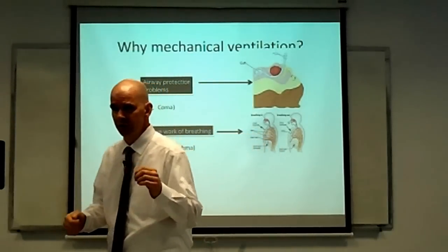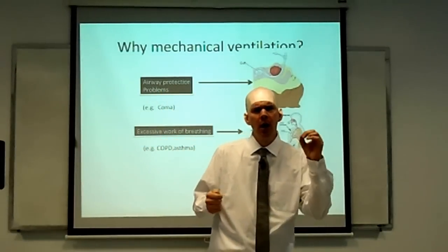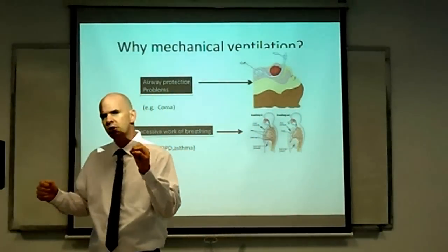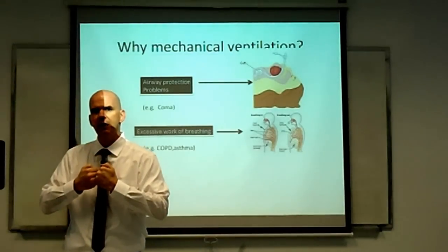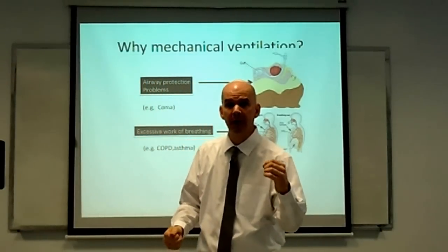That can be really dangerous because you might end up having the diaphragm get fatigued, and then the patient can die. Positive pressure ventilation can help us out in this situation, because you can essentially use electricity to power the movement of the air in and out of the lungs, sparing the diaphragm from having to work, giving it a rest so that it can come back and fight another day.